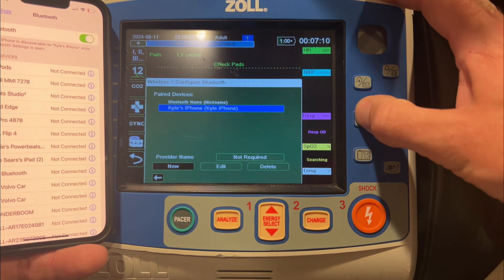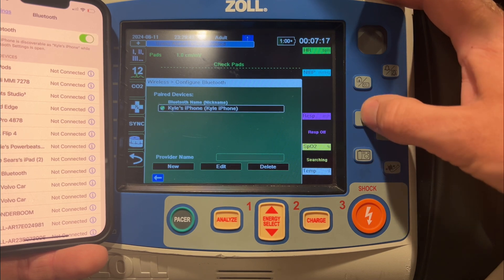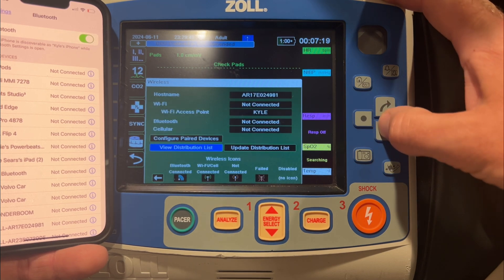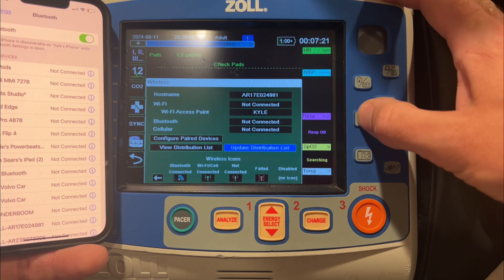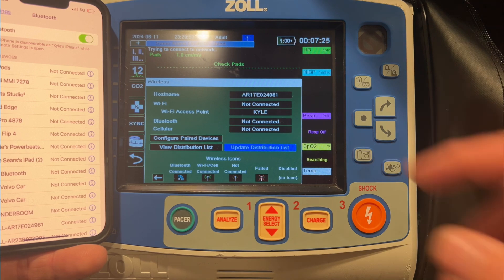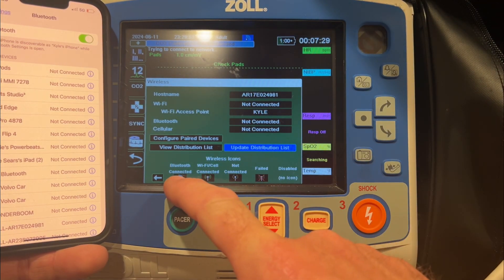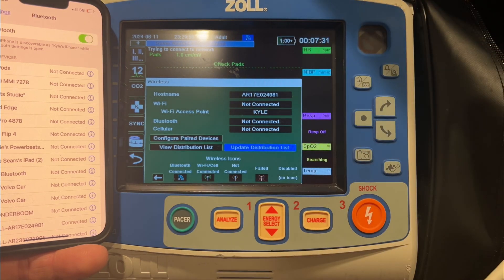Go up and make it the selection by hitting the Enter button. If you want to test the connection, you can go back and navigate down to where it says 'Update Distribution List.' When the monitor is connecting via Bluetooth, rather than the antenna icon with the yellow dots around it, you're going to see the Bluetooth connected icon. It's only going to be connected when it needs to move data.